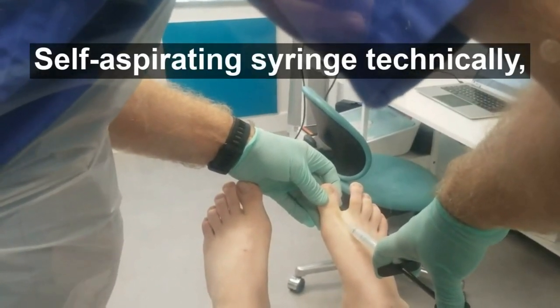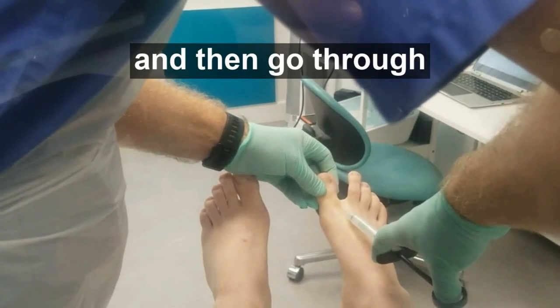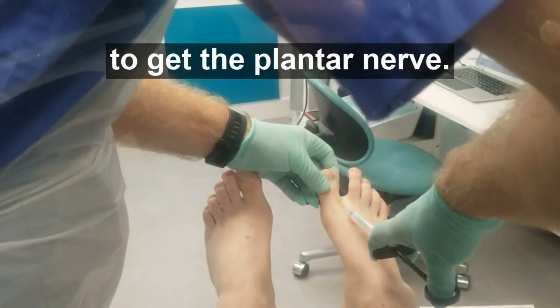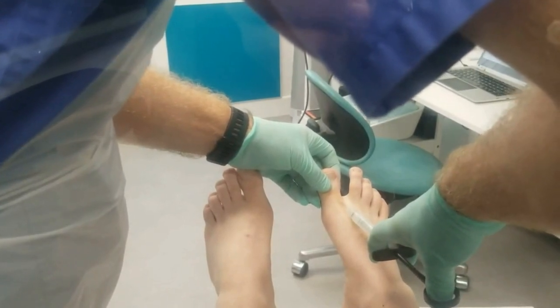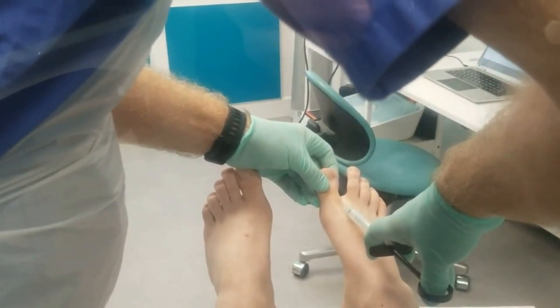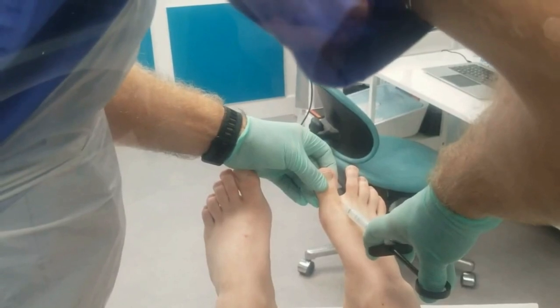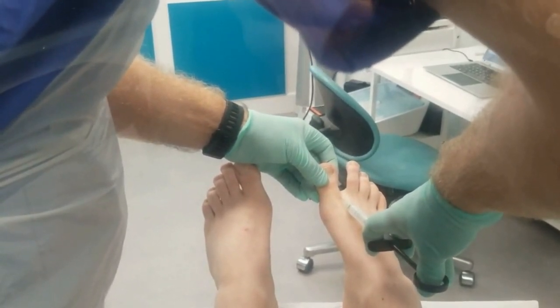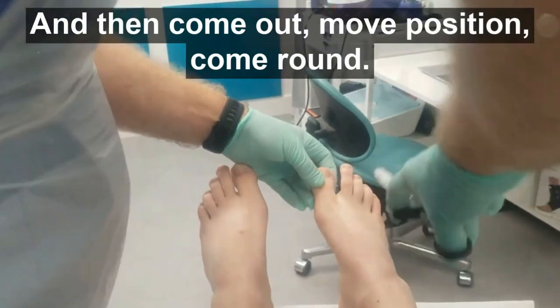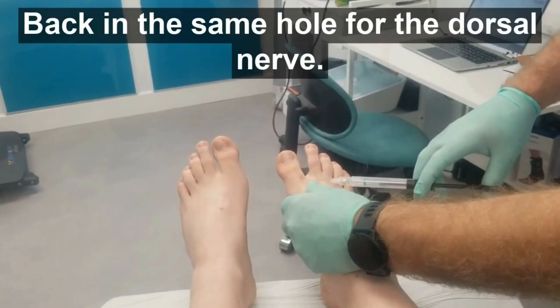It's a self-aspirating syringe technically. And then go through to get the plantar nerve, then come out and move position — coming back in through the same hole for the dorsal nerve.